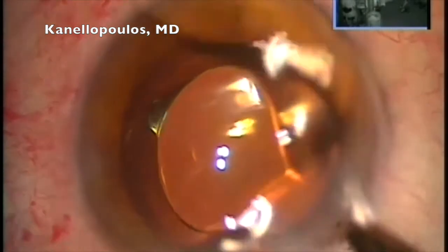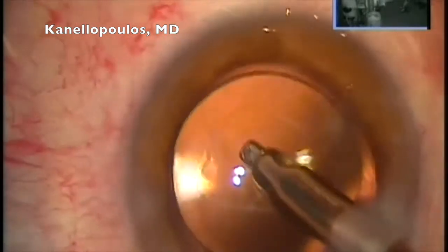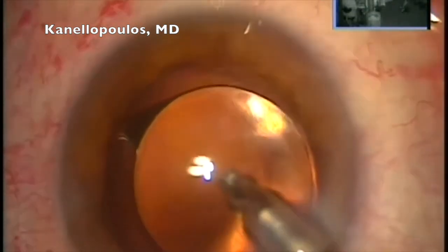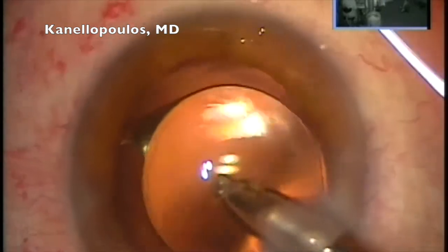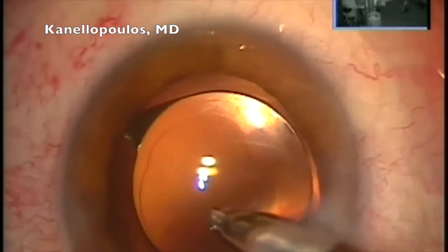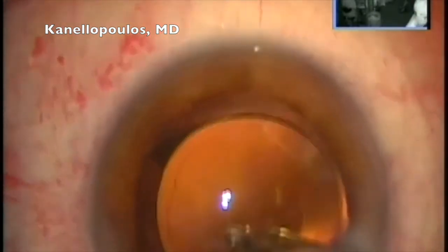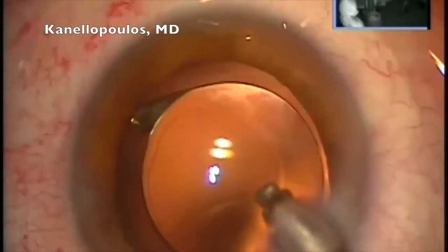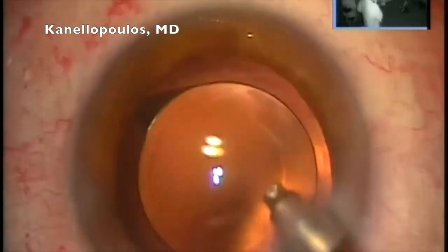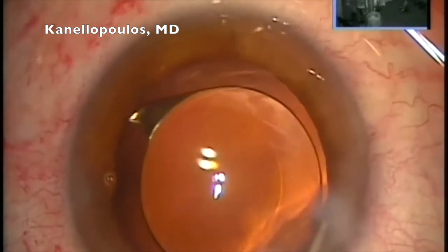I can see a fold superiorly in our view — kind of an arc. This is very dangerous folding of the capsule. It tells me that the bulb of my haptic, towards the left on the surgeon's view, has grasped the capsule bag. If I tease it more, I may tear it. Or I may have some loose zonules in that particular region. So I'm going to remove the viscoelastic and make sure I have no vitreous present. There is obviously no capsule rent. If I had manipulated the lens more, I would have probably torn the capsule — and I may have done that in the past. But fortunately I picked it up early enough. You may want to go back and look again at that particular moment where there was a significant fold in the capsule bag, just superior to the surgeon's view, at the superior arc of the IOL.